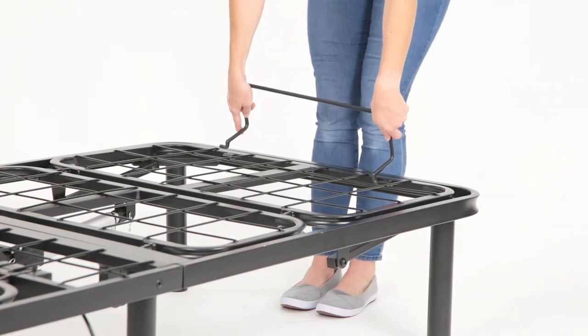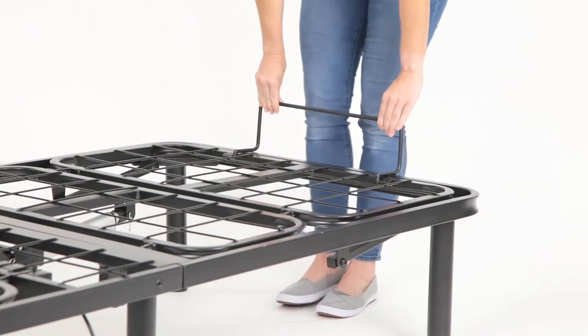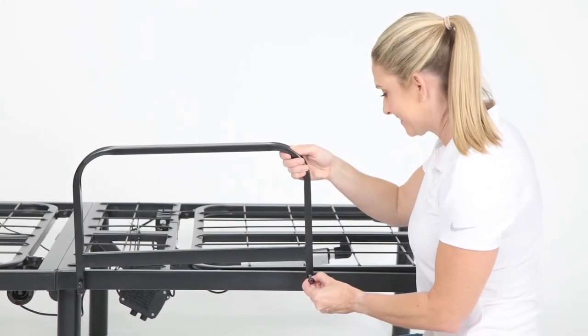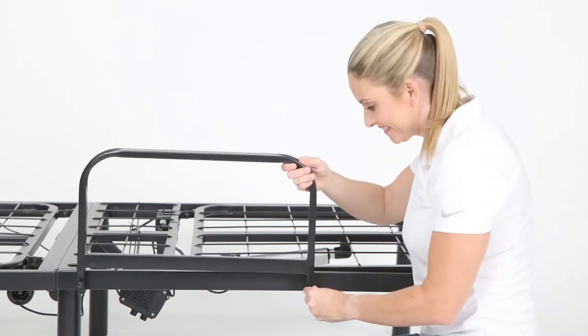Locate the retainer bar and insert the right end and then the left end into the openings located at the base at the foot of the bed. This may require a little force.